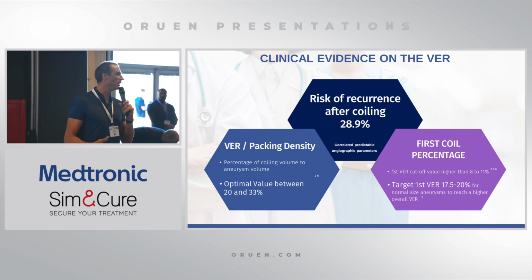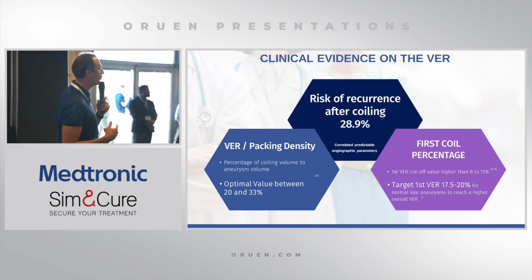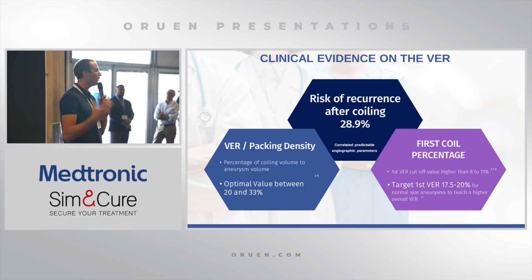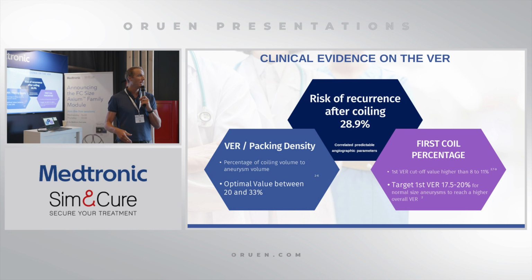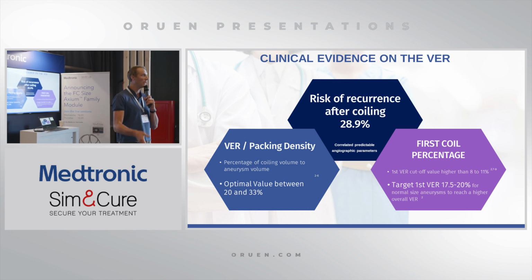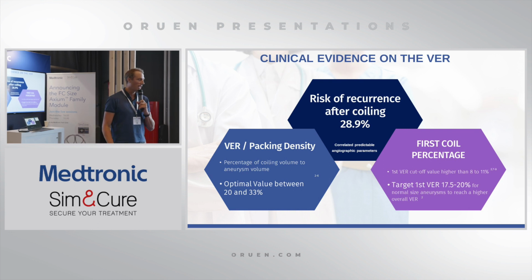But when we are using coils, there is a parameter that is still important in the literature: the volume embolization ratio. How much metal are we putting into the aneurysm? That's still a key point for the durability of the treatment. Coiling was started 25 years ago by the pioneers, some of whom are in the room here today. Fantastic treatment, and it's still there, despite 20 years of evolution of flow diverters. There is still a need for coils, so it's a very good treatment.